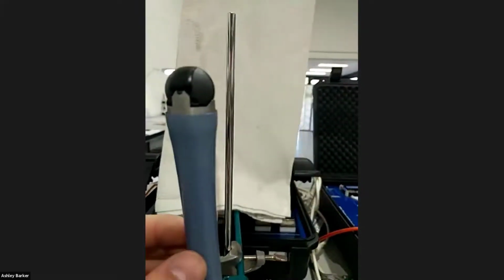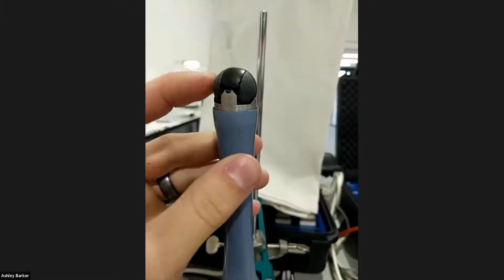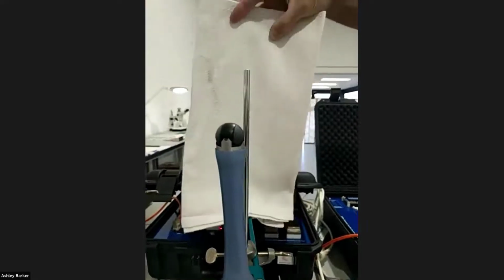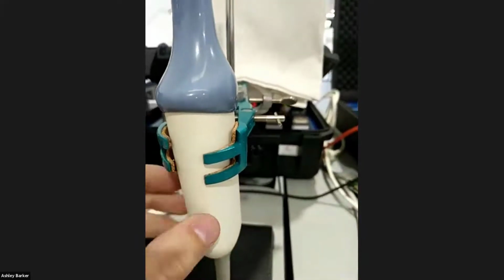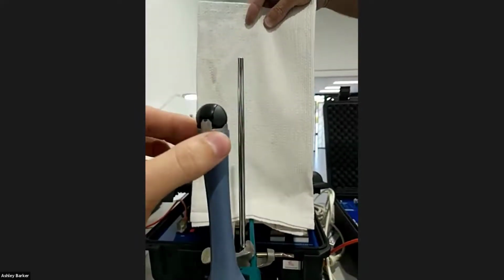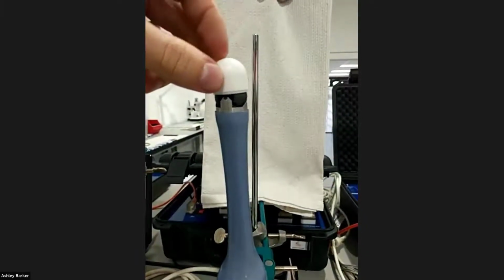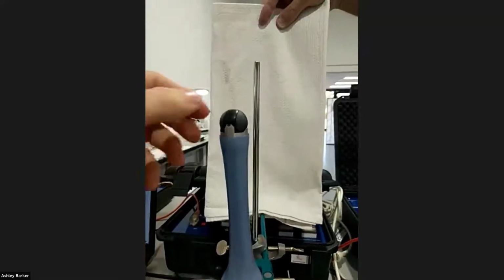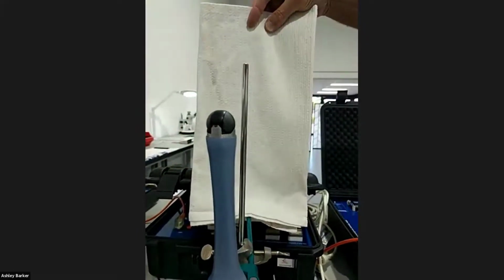Look at that. So this is a transvaginal 3D probe. You can see the little ball on the top is able to swivel backwards and forwards to give you your 3D. This is a very current probe; this is how they do it. There are some that don't move the array, but it's very common still to be moving the array like that. All the drive motor and everything is down in the handle here, and they run it up with little drive wires and move this on the top. On the top is a little cap that goes over, and if you drop that probe, that cap will bend in and smash that pivot ball section. It just smashes the pivots off, smashes the array out, and the whole thing falls apart.